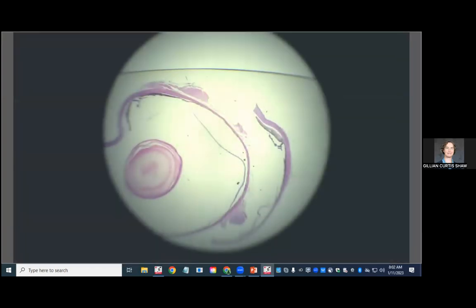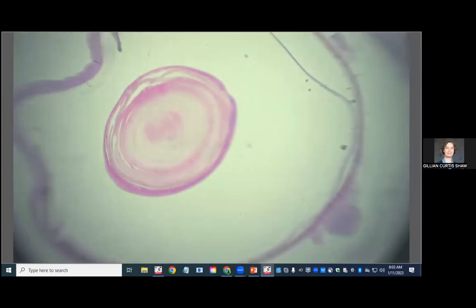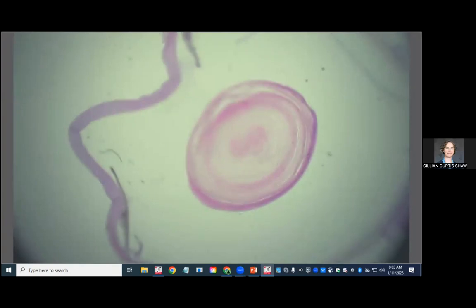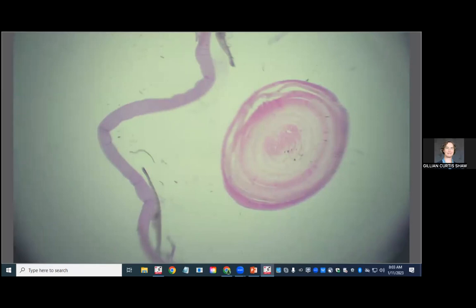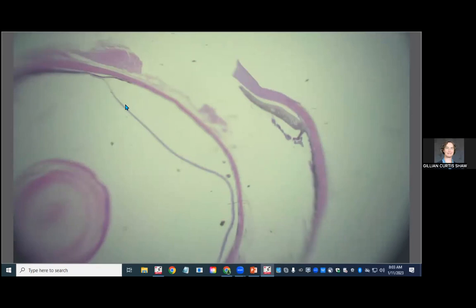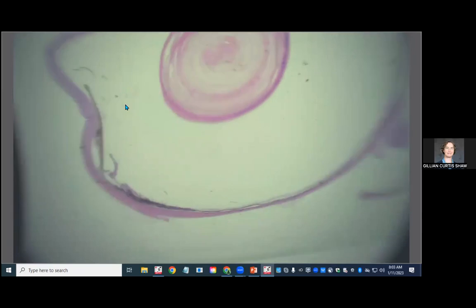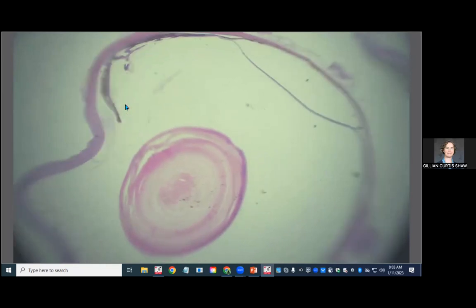We'll do subgross, even though there's not much to see. So on the left side of the screen, we've got the cornea, and then iris leaflets. The lens is obviously in the center. The retina is present. This section, we don't have the optic nerve head. If we really want to see it, we can go look at it. This is a deeper section because we're looking for something in particular. But the globe on subgross looks just as quiet and boring as it did on the gross image.